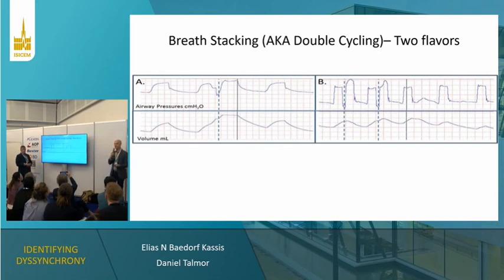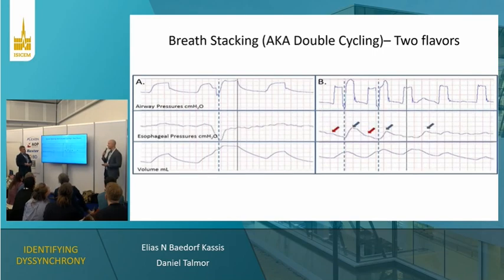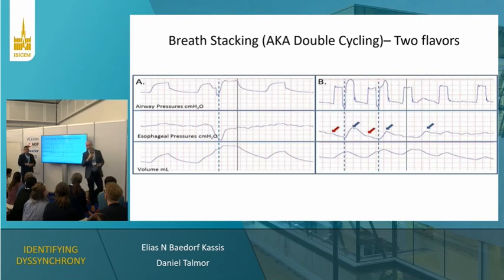And maybe some of your centers have esophageal manometry. I'm not sure if you guys are familiar with it. When you do have that, it does make it a lot easier to differentiate. You can see that the esophageal pressure dips here in response to the patient triggering the breath here. And then here you can see the esophageal pressure increases with the reverse trigger breath, which is consistent with a fully passive chest wall initially, and then subsequent diaphragm contraction and reverse triggered initiation.